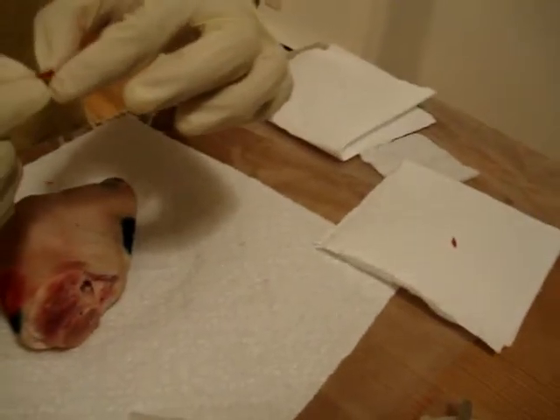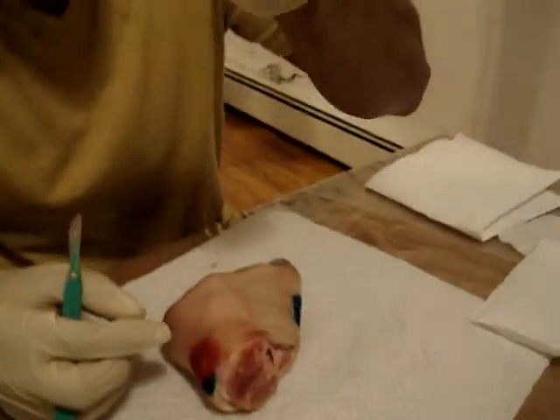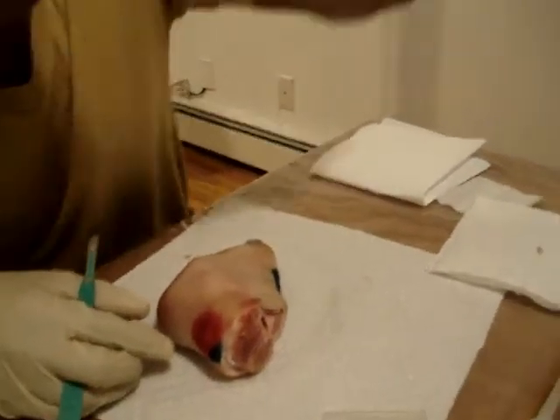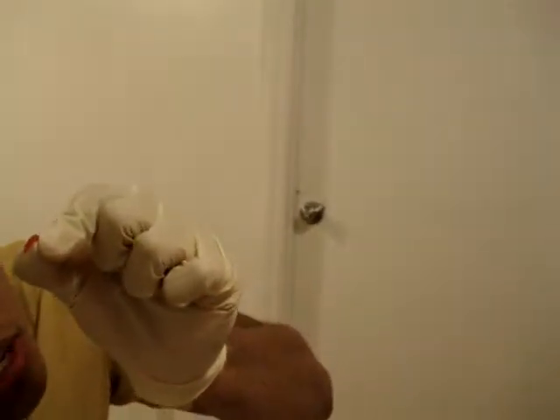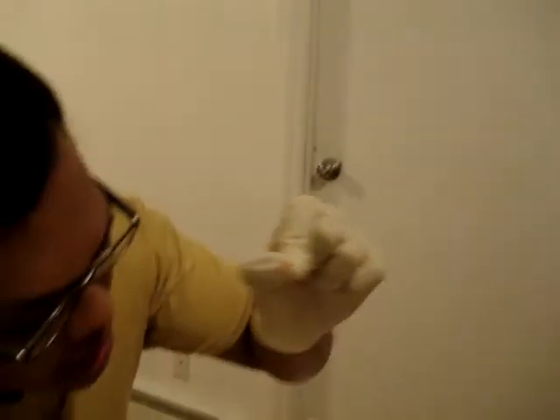Put it here. In order to determine if the depth is good, we're going to put it against the light. If we see that it is transparent, we are sure that it is light red and we did a good job. So there, it's transparent, I can see it. So that is a good shave.